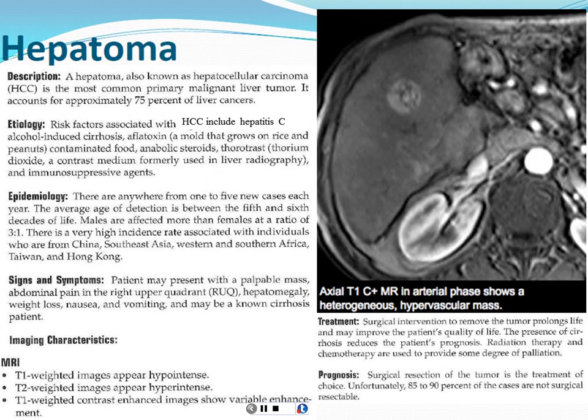It won't cause any damage to the liver. It just doesn't help with our picture at all. So what you'll be looking for when you do an EOVIST study is to start to see those branching structures, the bile ducts filling in with contrast. And if you get into a center that does a lot of that kind of imaging, you'll know when to look for it and know when to wait another 10 minutes to try to image the patient again. And like I said before, if you ever have any questions, always call the radiologist and see if it's adequate.